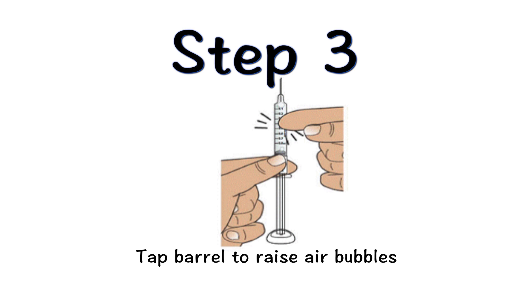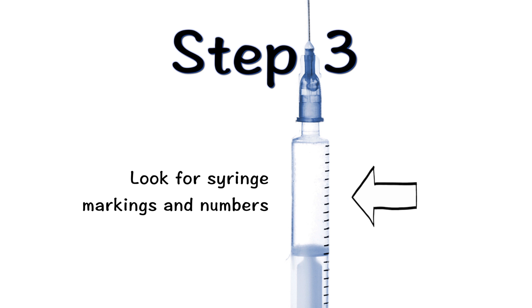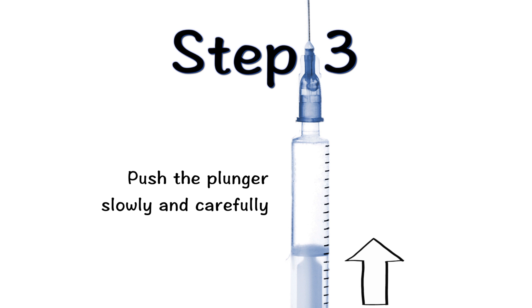Before you adjust the medicine, hold the syringe with the needle end facing up and gently tap the barrel to make sure any tiny bubbles rise to the top. Make sure you can easily see the syringe markings and numbers. Then, push the plunger slowly and carefully until the top edge directly below the dome of the grey rubber stopper is even with the line that corresponds to your prescribed dose.